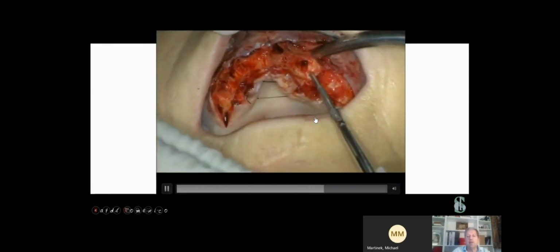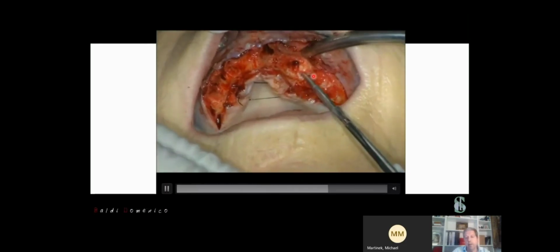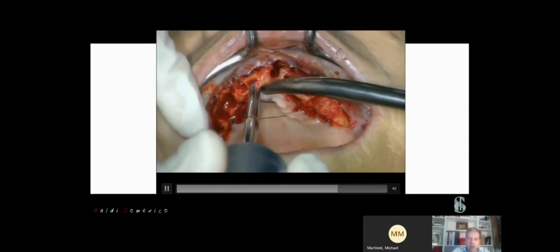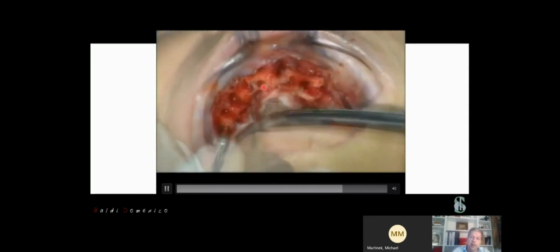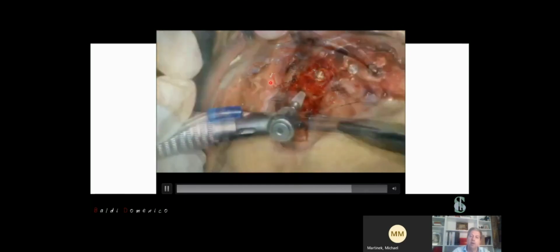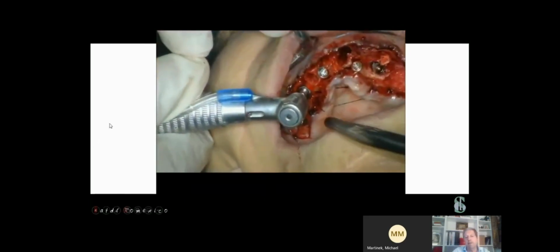So now we can start to prepare the new implant site with the mallet. Look how it's possible to prepare our implant site perfectly, maintaining the bone. And now we can place the implant.